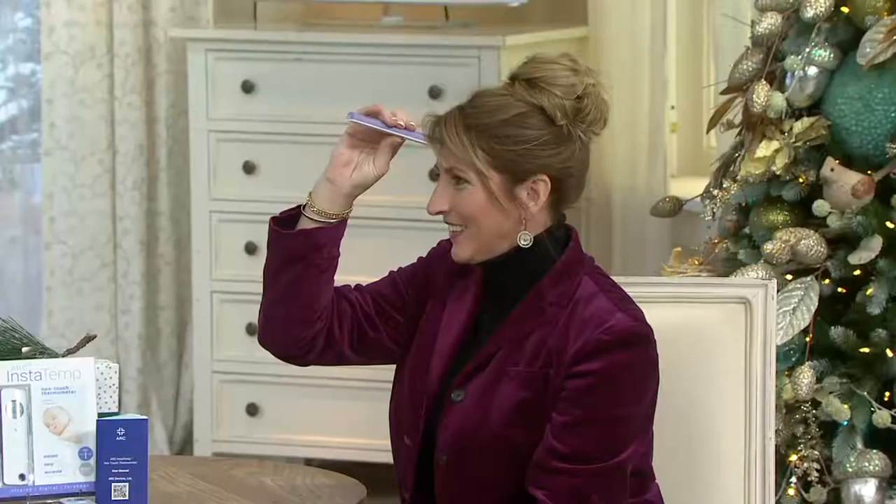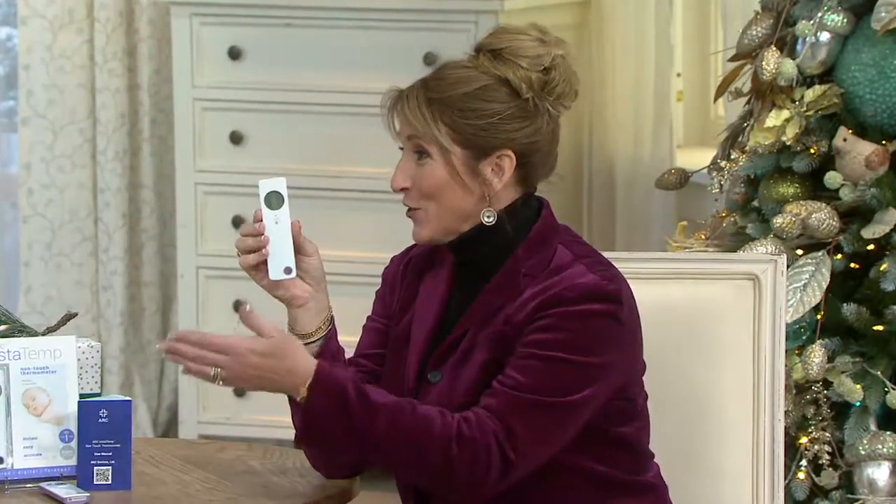I had a chance to put it to good use in my household with a one-year-old and a two-year-old. It's the Arc InstaTemp thermometer, and what's unique about it is what you see Janine doing right here — you don't have to touch someone to take their temperature anymore. You're not cross-contaminating someone or your children.